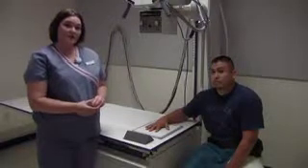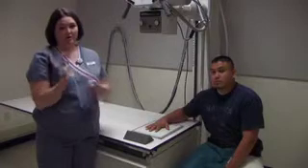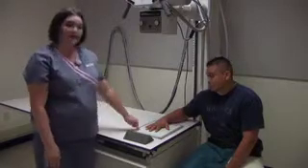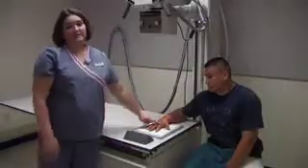We're going to start with the PA projection, which is going from the back of your hand to the palm of your hand, exiting. So the palm of the hand is going to be on the cassette. You want the central ray to go through the distal end of the third metacarpal, which is your third knuckle. And that's going to be to the center of the film.